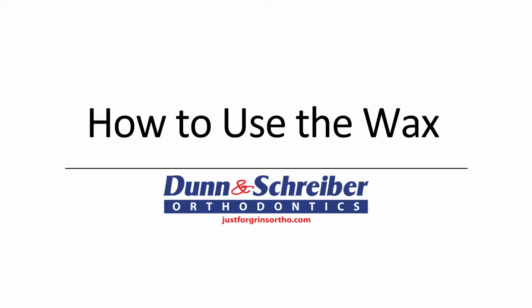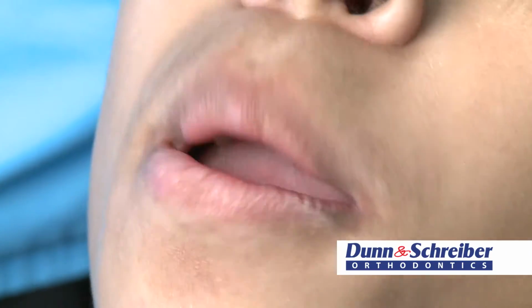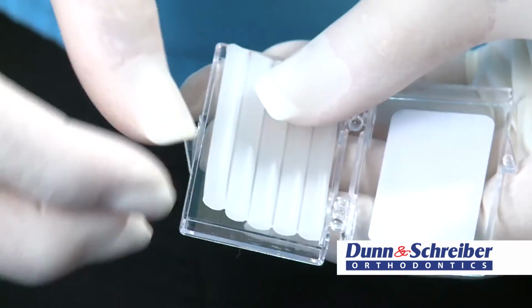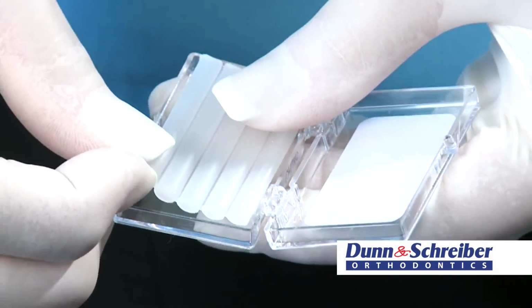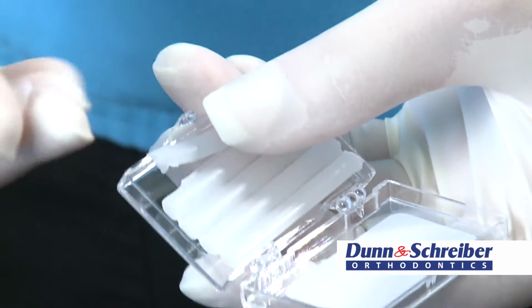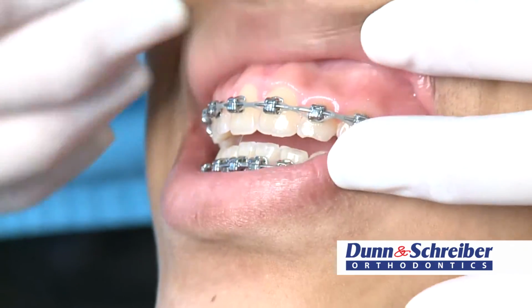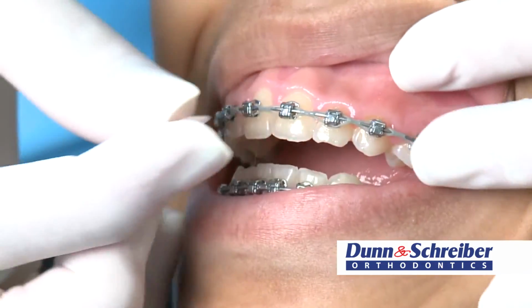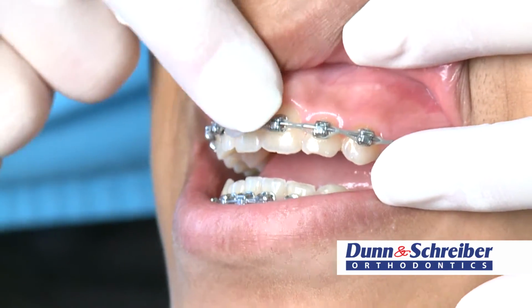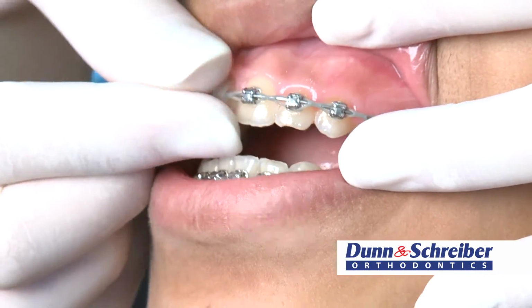Okay, now let's talk about wax. As you're getting used to your braces, you might feel some sore spots on the inside of your cheeks and lips. And if you do, you can use orthodontic wax to cover the area that's bothering you. Just pinch off a small piece of wax and soften it by rolling it between your fingers. Then just place the wax over the spot that's bothering you. Just remember to take the wax out before you eat or brush your teeth. But if you don't and you accidentally swallow some, don't worry about it. It's not harmful to you.